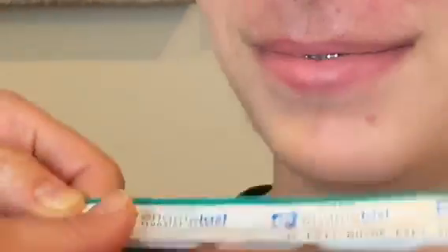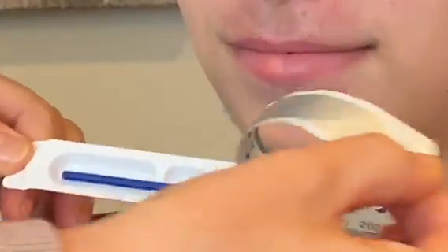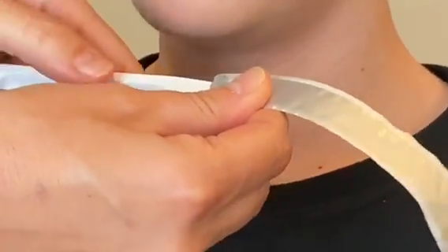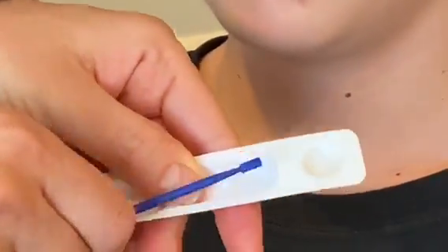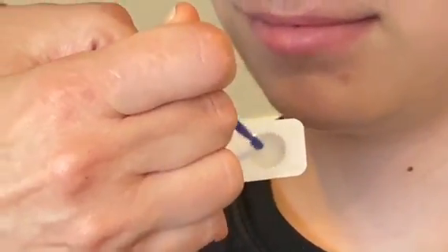First of all you're gonna take the varnish, squeeze it like this to open up the end. When you pull it out it's gonna be very sticky. You take out the brush and stir it — it's kind of a thick consistency, but mix it up again.